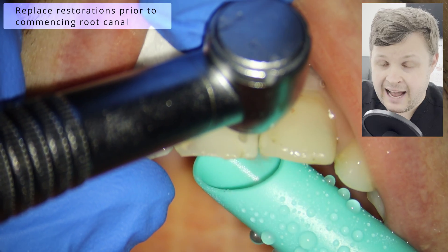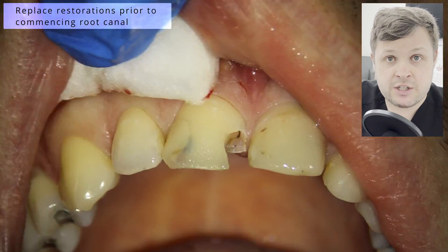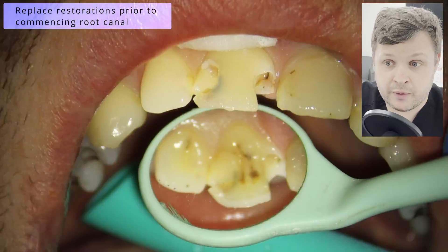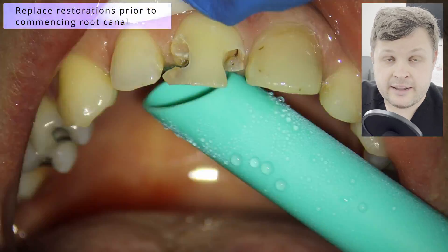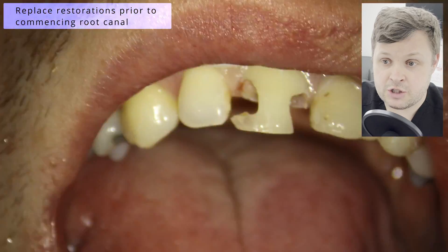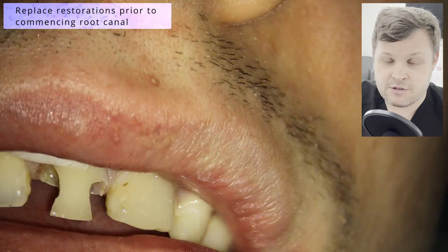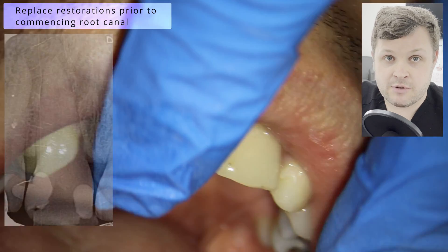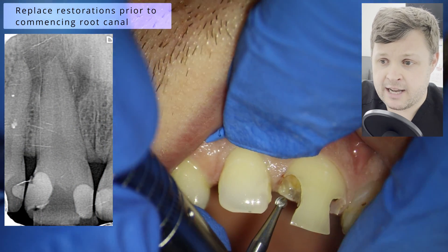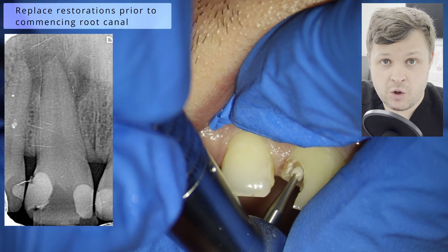The first portion of this root canal was making sure the restorations were adequate, because if you cannot achieve adequate restorations on a tooth there's no point doing the root canal. The patient had come in and complained that the tooth had stains in it, and when we took an x-ray it also had symptoms. You can see a really large radiolucency. All I'm doing here is just removing the old composite fillings.